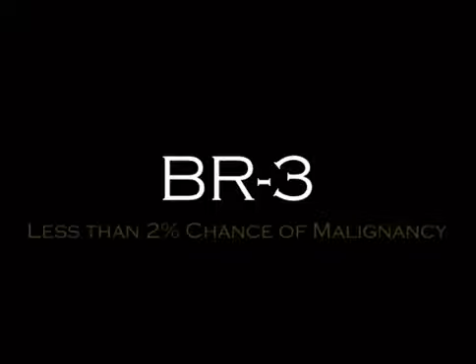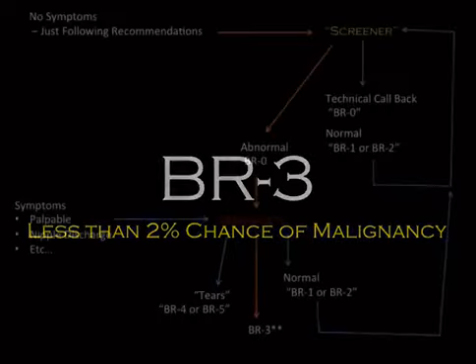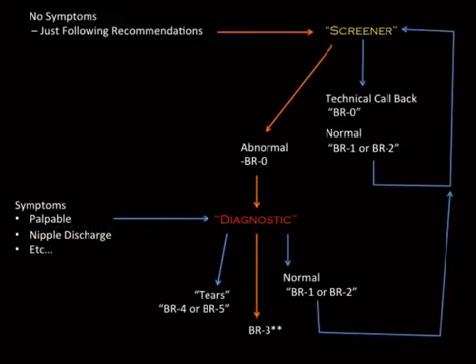Remember, BI-RADS 5 means that there's like a 95% chance of malignancy. BI-RADS 1 or BI-RADS 2 basically means there's 0. What does BI-RADS 3 mean? BI-RADS 3 means there's a less than 2% chance of malignancy. That is a highly testable statistic. Remember, since mammo has such limited actual information in it with regard to pathology, that trivia like statistics tends to become fair game. The more shallow the pool of information, the more random the trivia becomes.